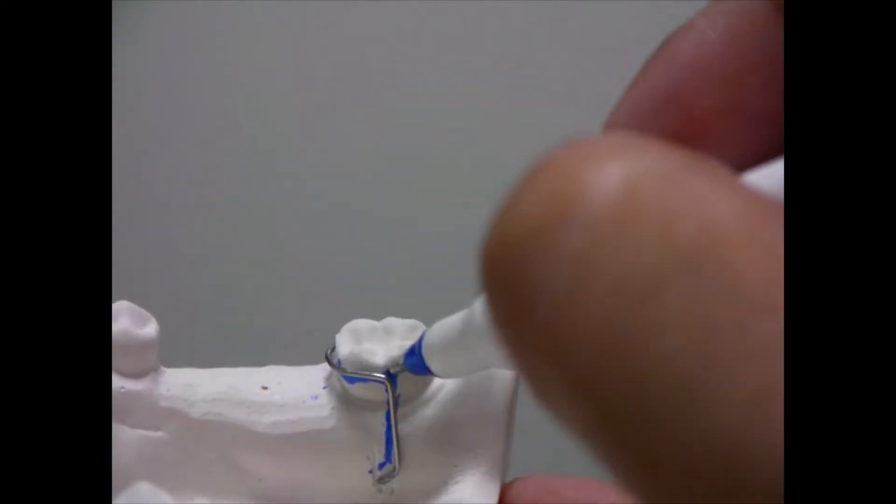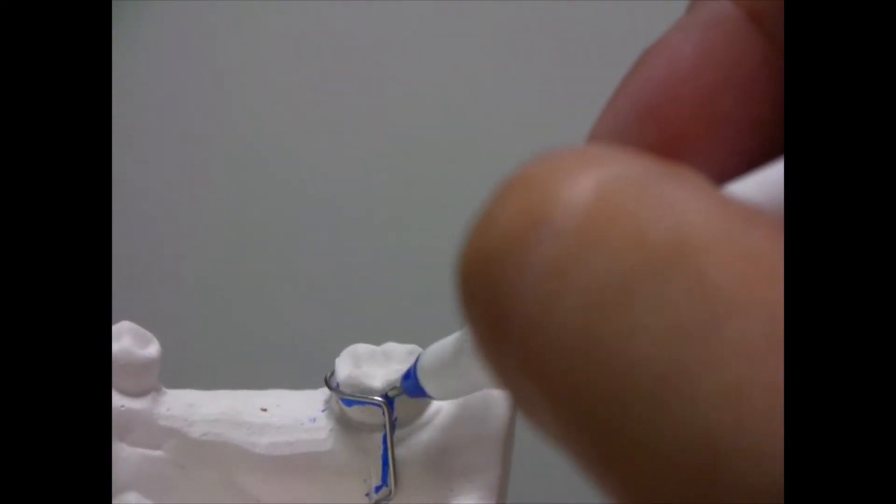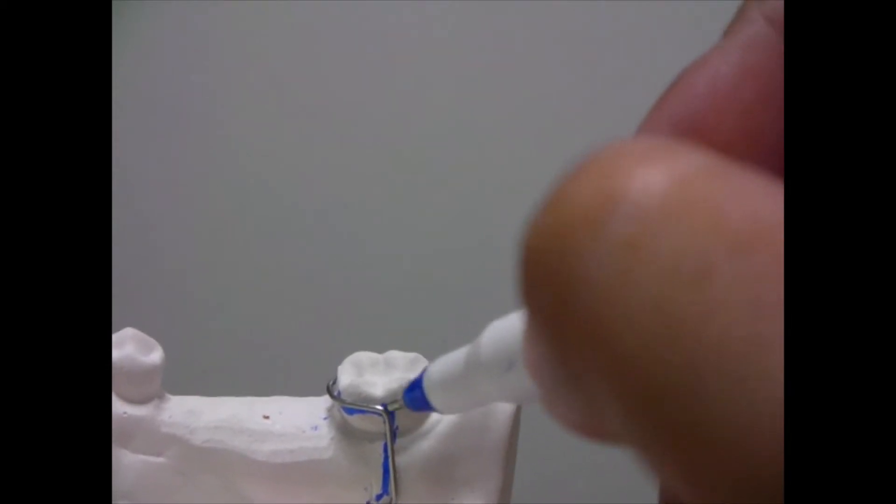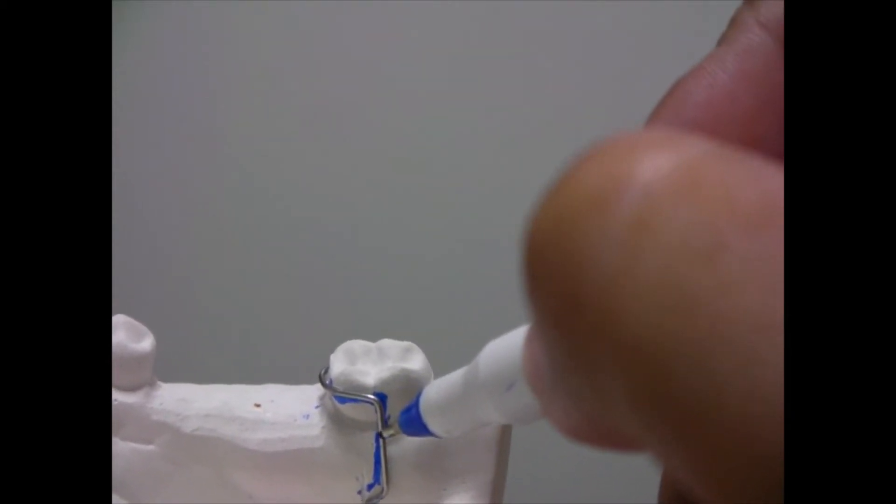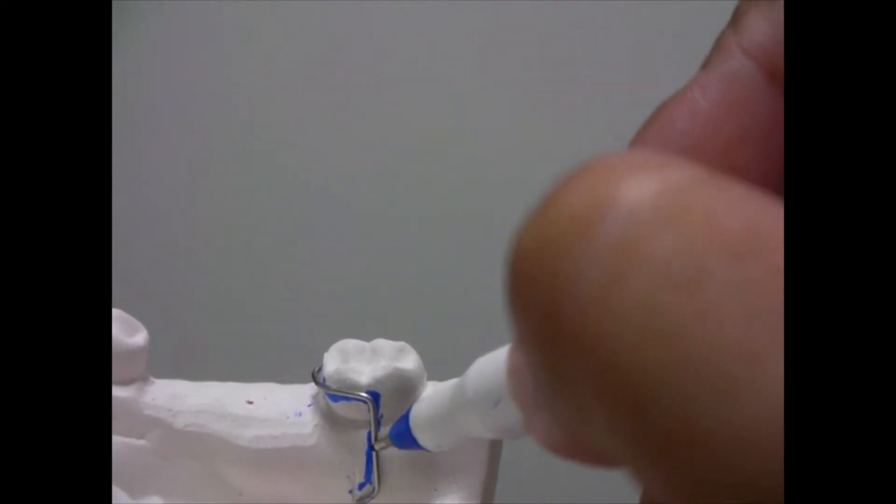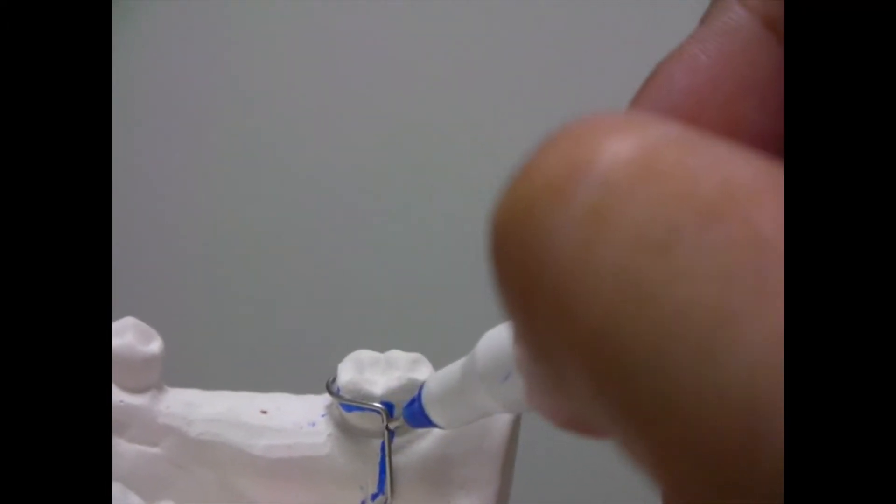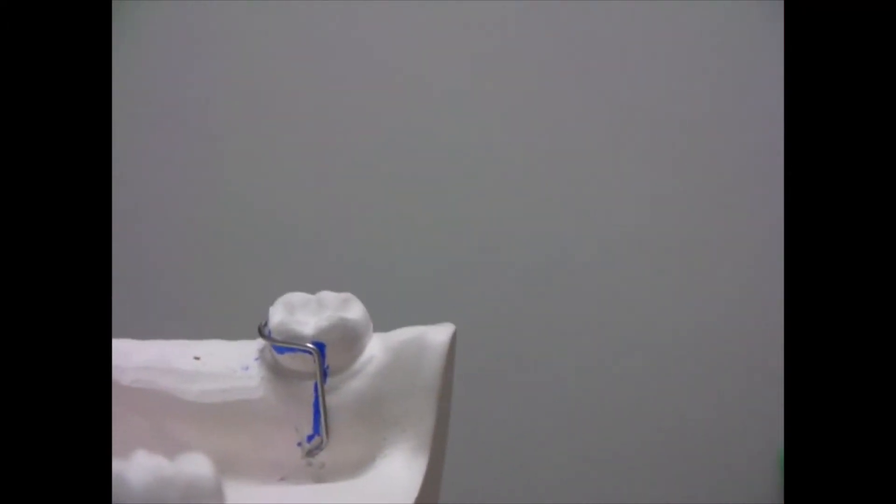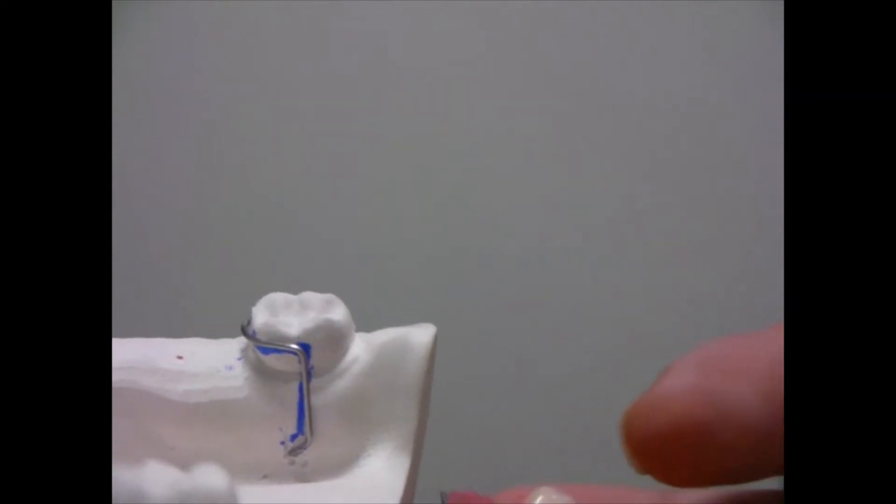This part is the reciprocal arm which is going to follow the contour of the tooth towards the lingual side or the palatal side depending on the maxillary or the mandibular arch and then we have this minor connector. This minor connector is actually going to connect this part of the clasp to the palatal plate like you see over here.